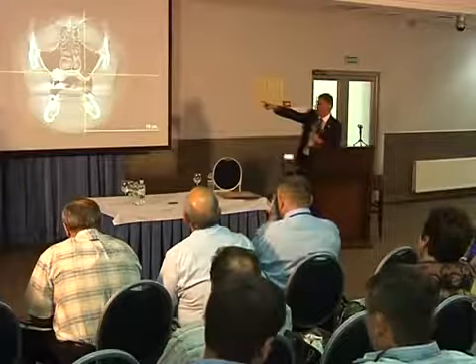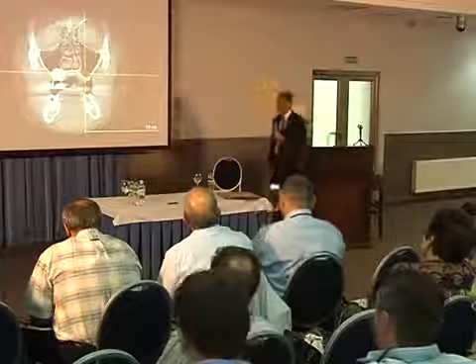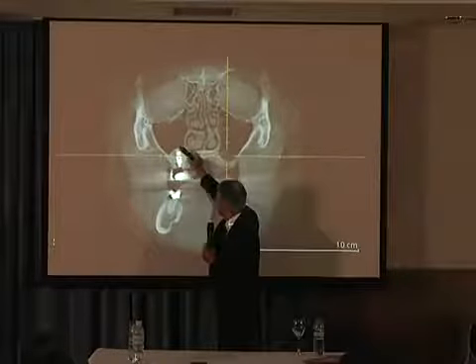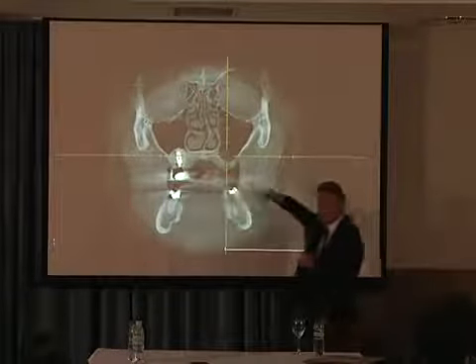This is the other side. Look, the implants on the other side. 10 years ago. Still bone available around the implant under functional loading.